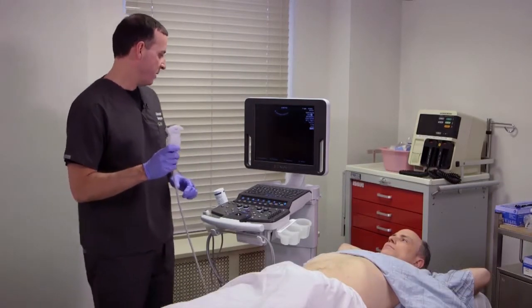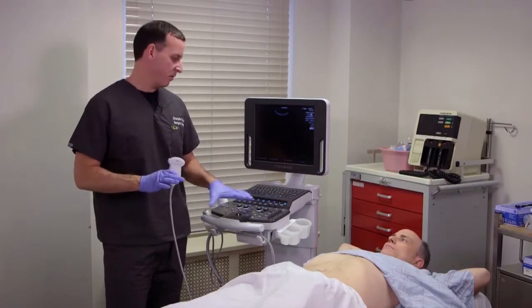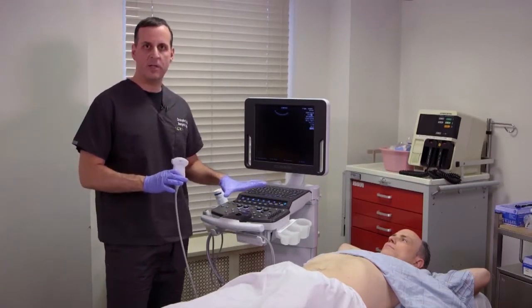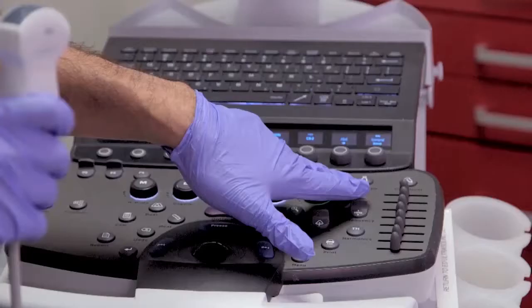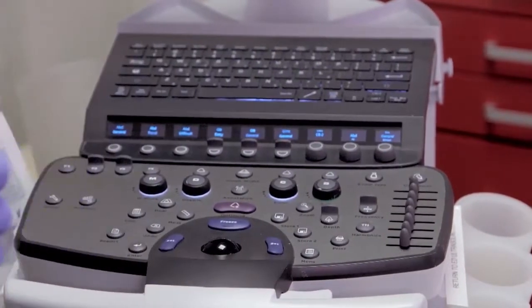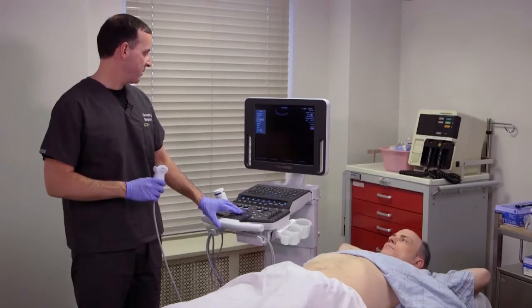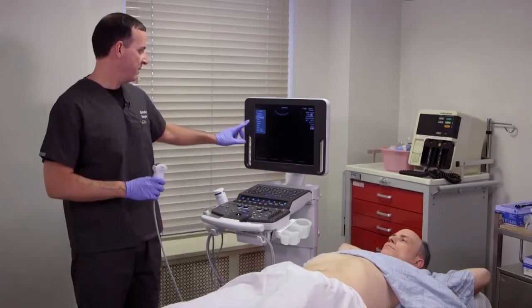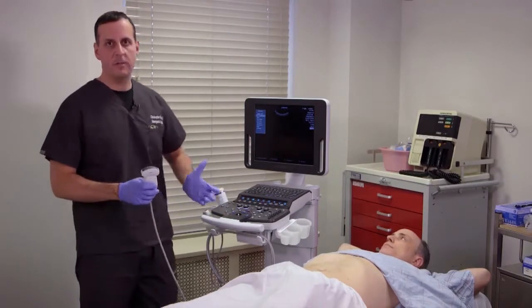Once we have our transducer in hand, we also want to make sure we're on the correct presets. The presets should already be set up by Zonare prior to the exam. You're going to hit the exam type button, which will bring up your presets on the left side of the screen. We're doing the FAST exam, so we come here to FAST, hit set, and now we're ready to go.